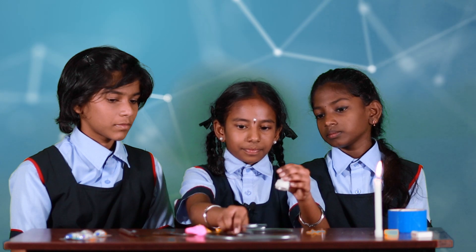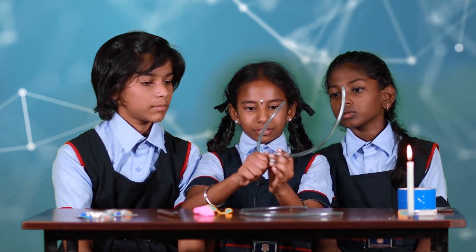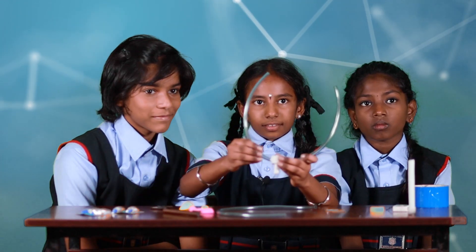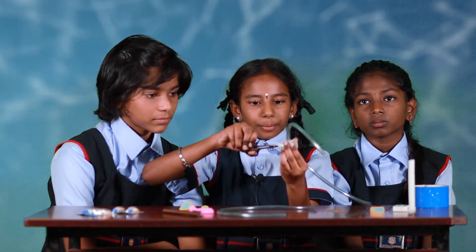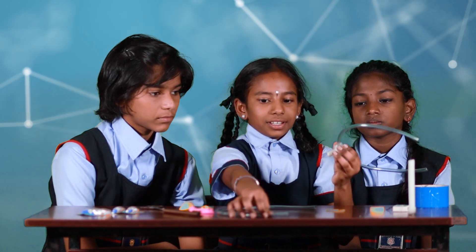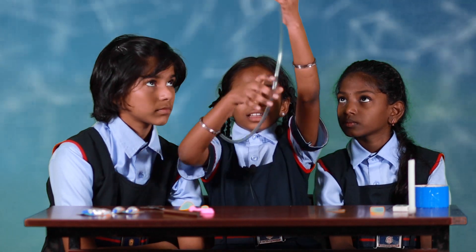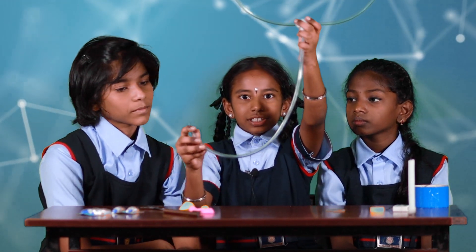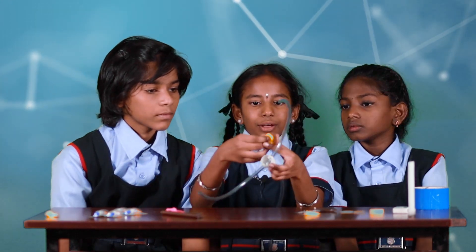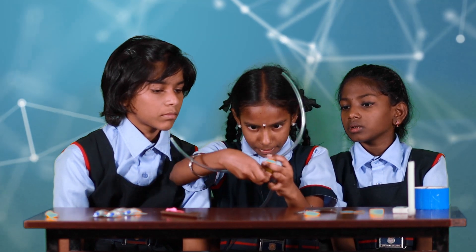Now take the tubes. Take another tube and insert it into a hole. Now take the scissor and put another hole in the bottom. Take another part and fix it inside. Cut the tip of the balloon and cover the opening with the balloon.